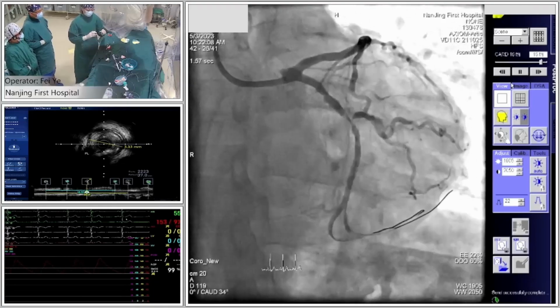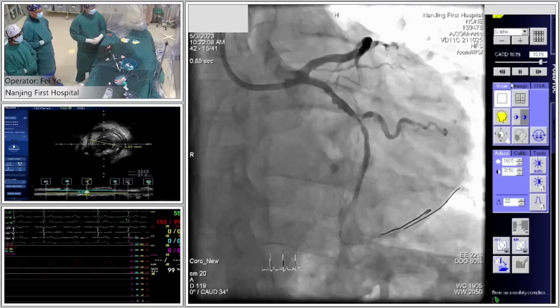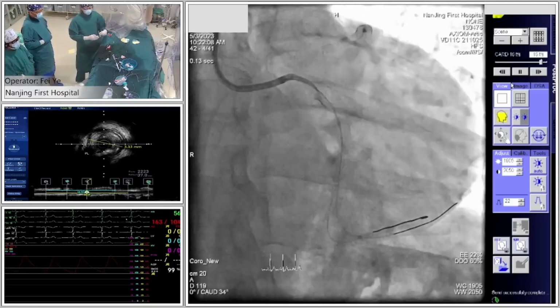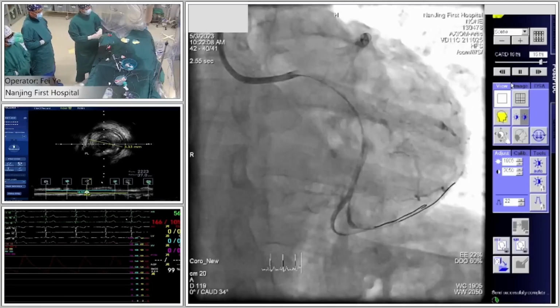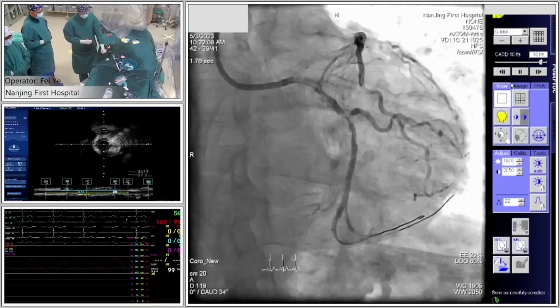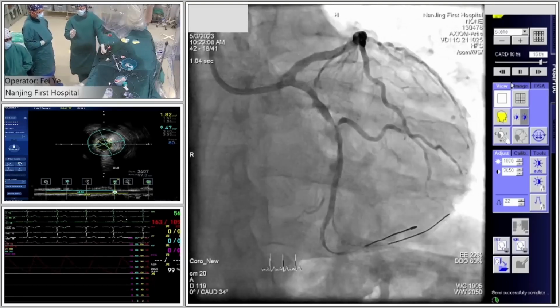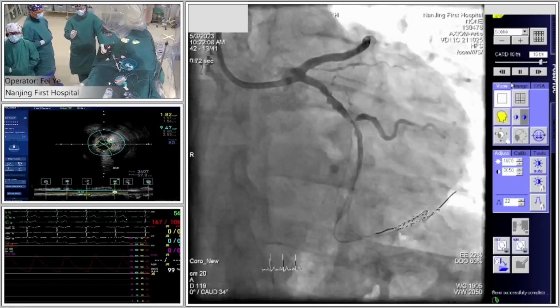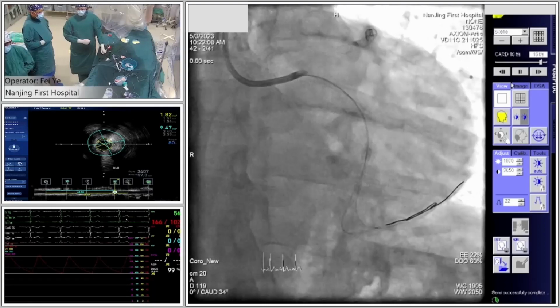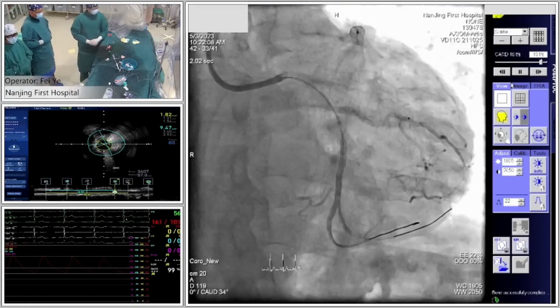But some information from the IVUS can tell me how to select the wire. So could Pentel tell me if you can find some information of the side branch of the OM from the main vessel IVUS? It's very, very difficult just because the bifurcation site was very stenotic. Maybe you cannot find the OM. Could you show the IVUS on the screen?